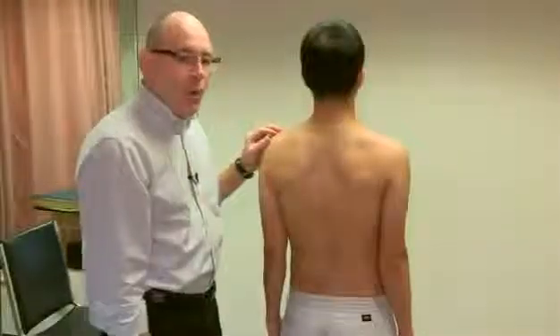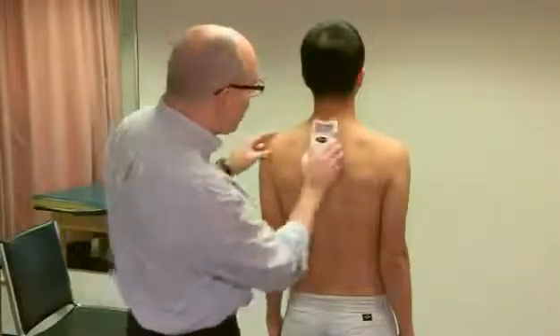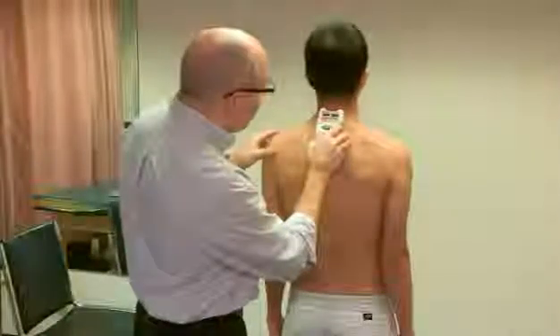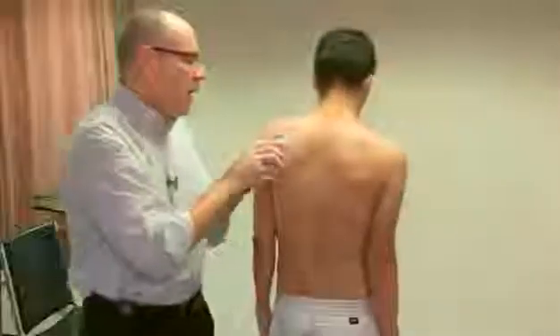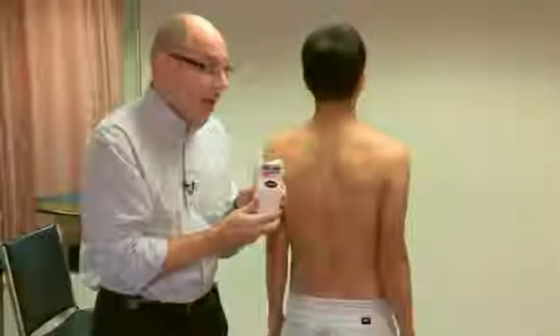We're going to continue with right lateral flexion. Sir, keep equal weight bearing on both lower limbs. I come up to the same position, set it. Now bend to the right as far as you can. I mark it again, and we end up with 54 degrees, similar to the other direction.